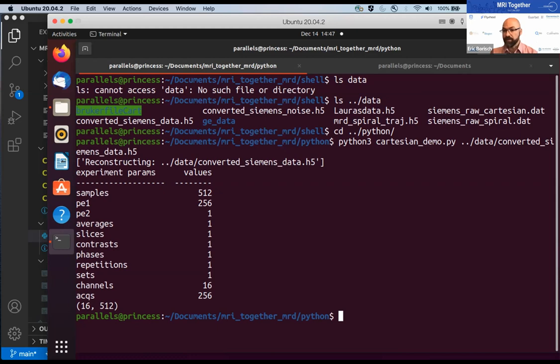I'm not familiar with the Siemens format itself, but I could imagine something like with a GE system where you might be able to archive off, so to speak, the P-file header, which is small relative to the size of the P-file, inside of the MRD format, and then be able to, if you really wanted to, reconstitute the P-file later in a bit-exact manner. I don't know if that's functionality that's there, but I could imagine that might help people try using this format if you know you can get back. Exactly. It is possible to isolate the header file from the Siemens data set, and that can help to reduce, particularly for large 3D data sets, having them both doubled up in terms of memory usage. So yes, that's a good point too.